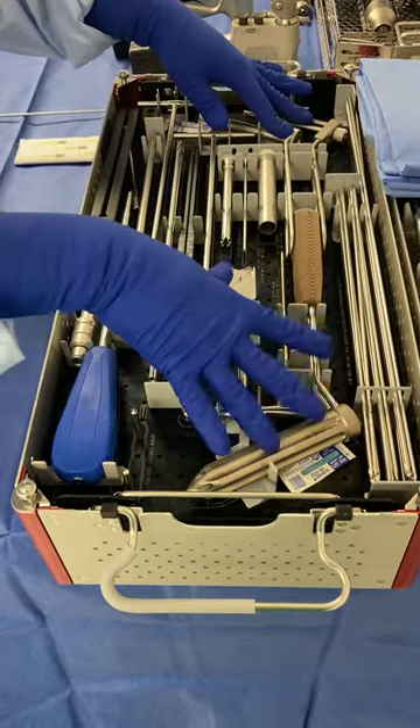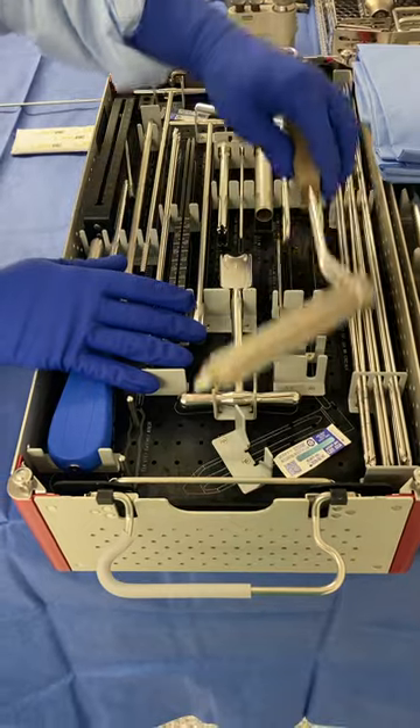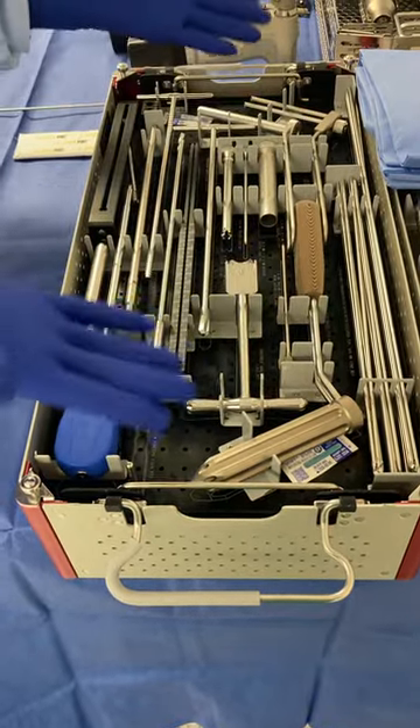They have different guides that some doctors like to use. This is called the Gatling gun — it just helps them get their start point for their drill. My doctor doesn't use any of this, so I'm not going to take any of that out. These all serve the same purpose, just a slightly different style.